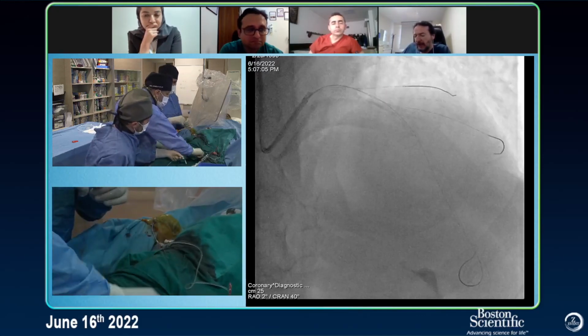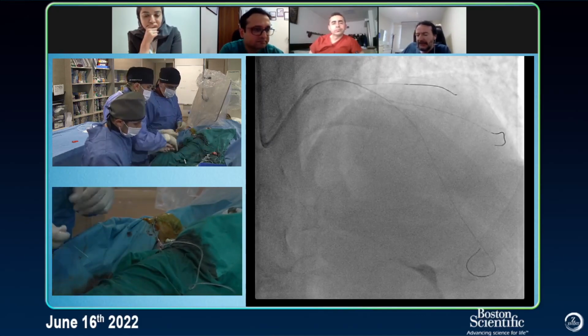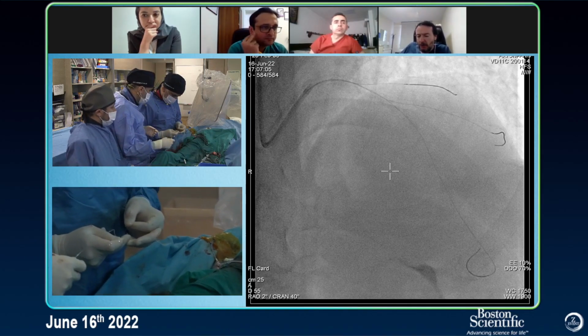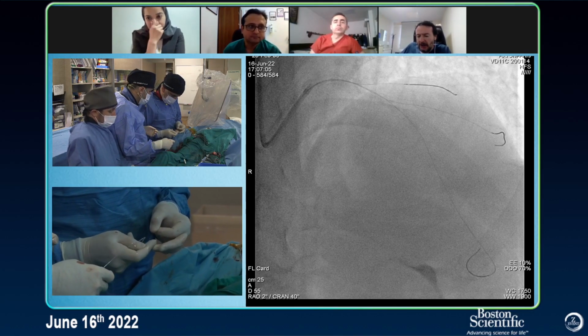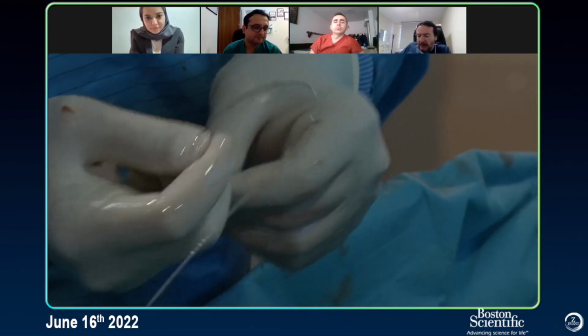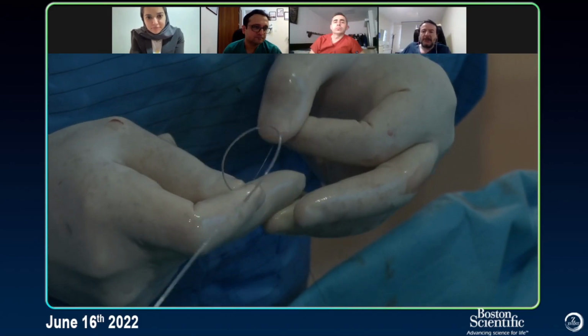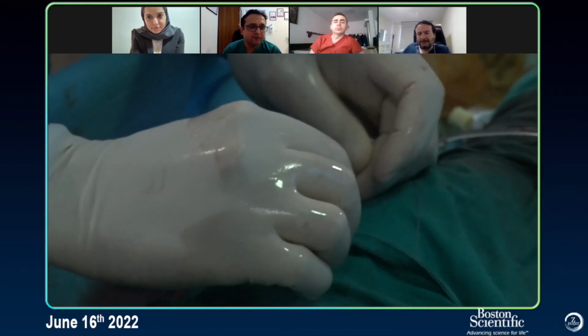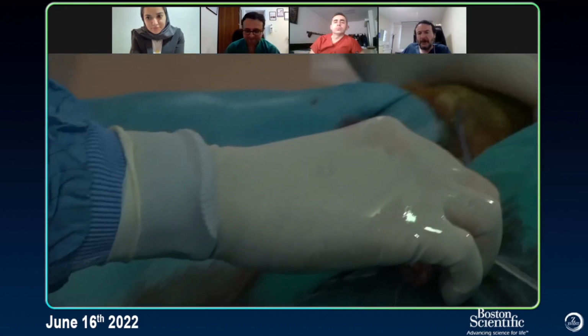But usually when I go with the 1.5 burr, if you work with patience and very slowly, you don't need any kind of pacemaker. Of course, you should always be looking at the pressure and at the rhythm. That's the key. So essentially both, you haven't really moved away from pacemaker completely. Yeah.